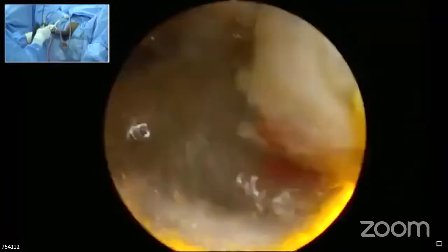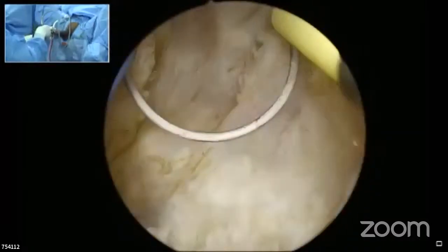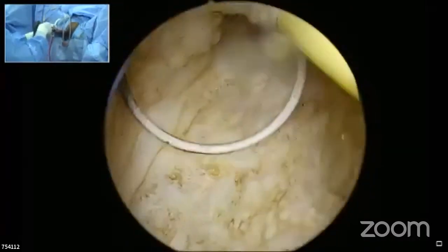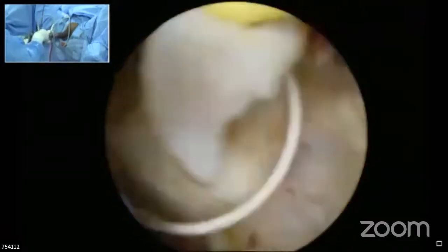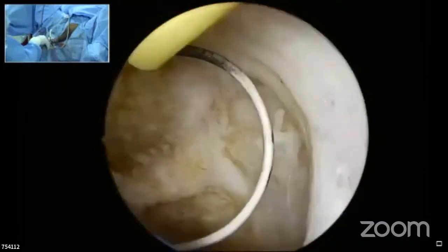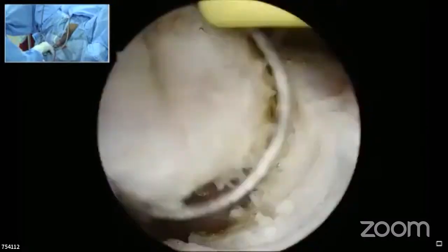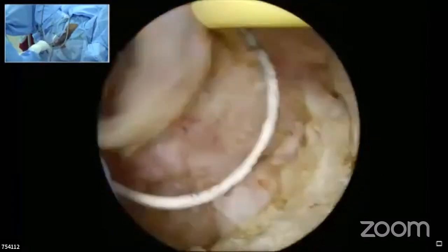I used that orange box in 98, from 98 to 2002. In between came the Wolf also, and Wolf has a thick loop, following the concept of Pearl Mutter to use a thick loop. Then came the Storz and then Olympus.